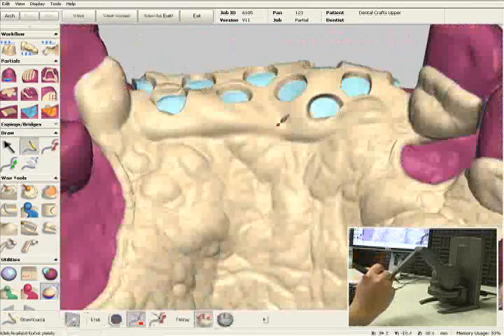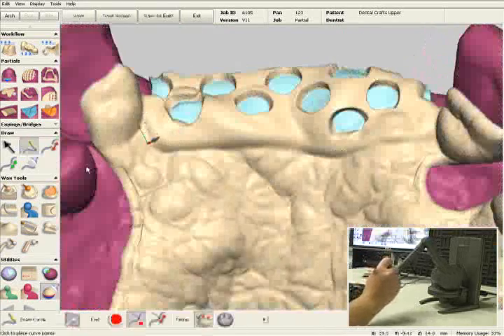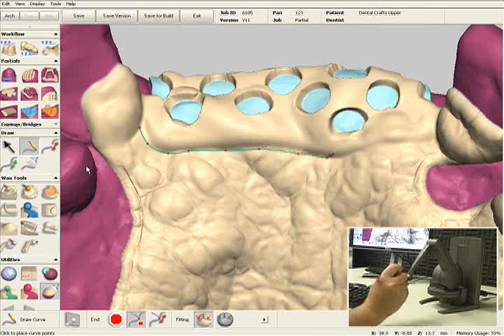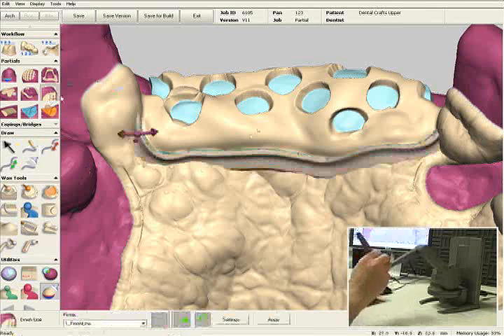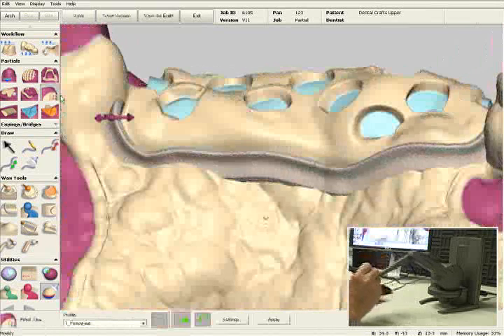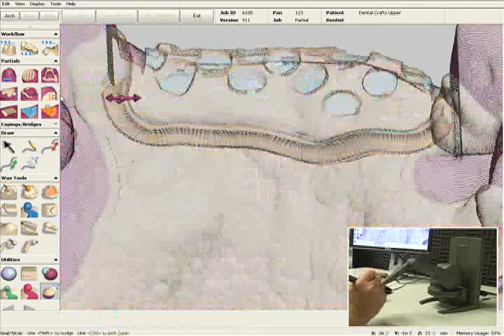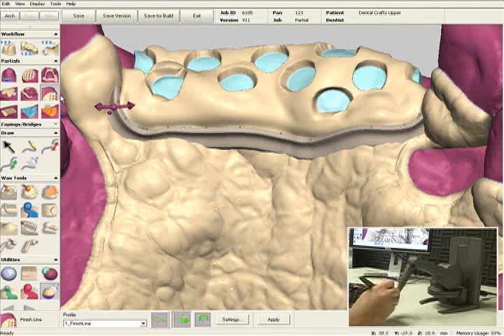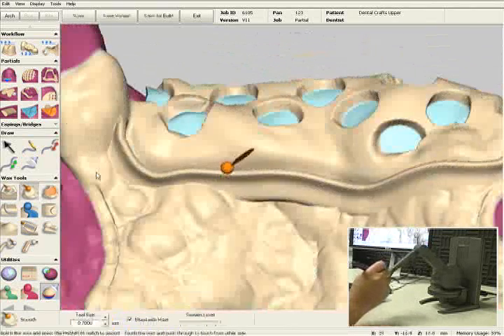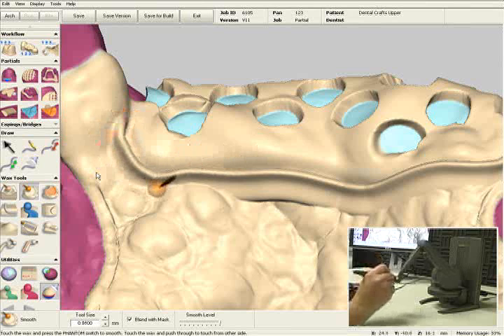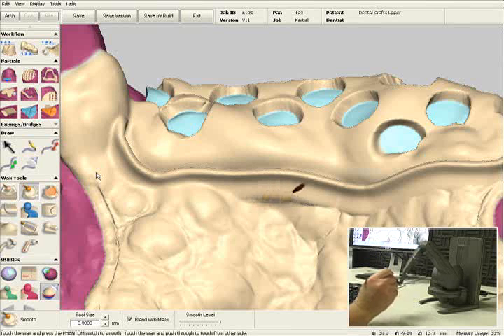Let's add another finish line in the anterior mesh. I'll select the finish line tool — here's the three-dimensional preview again. Once again, we can use this purple arrow to rotate the finish line, and use these points to change the shape. Or if you're happy with it, just click Apply and turn that into digital wax. I'll select the smooth tool and blend that into the major connector.